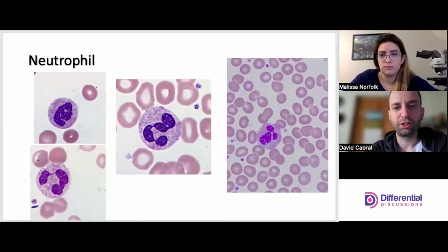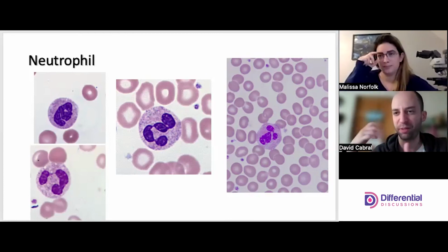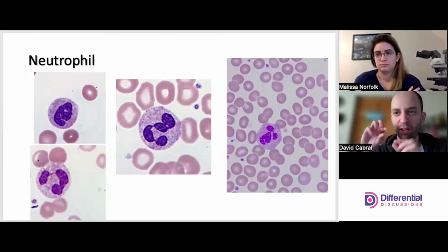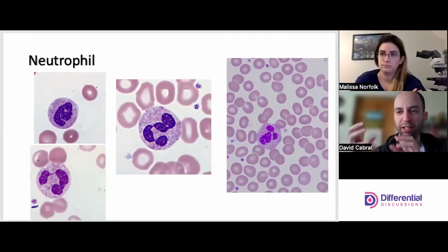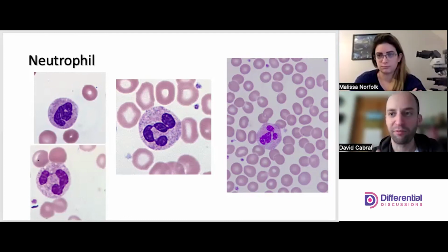We tend to use our imagination a little bit too, because spatially there are a lot of factors to how well a filament will be displayed. I can take lobes and three-dimensionally put them on top of each other, and it's going to be difficult to see. But we kind of know it when we see it. Like the cell in the top left, one might say there are no filaments there, and I would argue there probably are. We just can't quite see them because of the orientation.